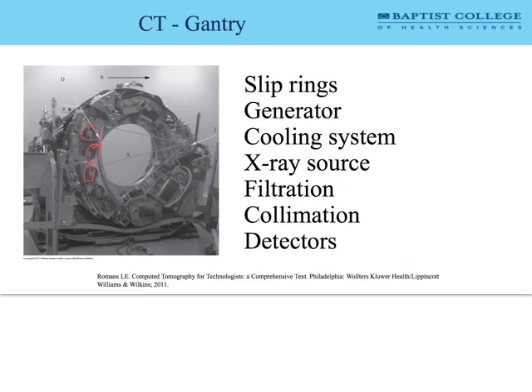So looking at crystals at the bottom of page 118, there's a number of things we can say about these detector elements. They've been made from a variety of different materials. Some of them are materials that we might use in nuclear medicine, and some that we might use in computed tomography or computed radiography. Things like cadmium tungstate, bismuth germanate, and cesium iodide should probably sound familiar to some folks. And then certain ceramic rare earth materials like gadolinium, which is also used in nuclear medicine, and yttrium, which nuclear medicine uses, yttrium-90, sometimes for therapeutic treatments.